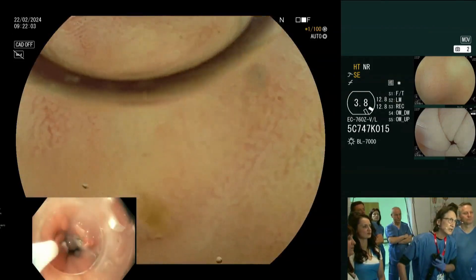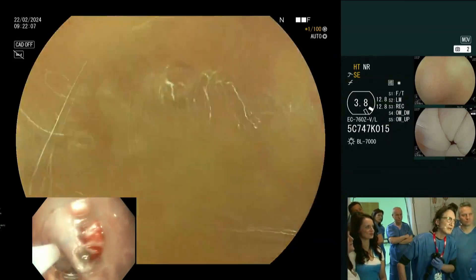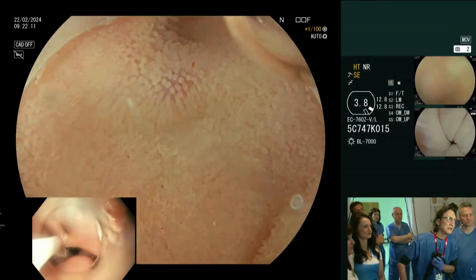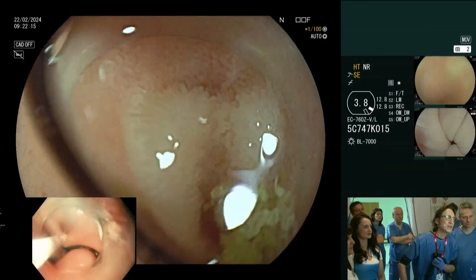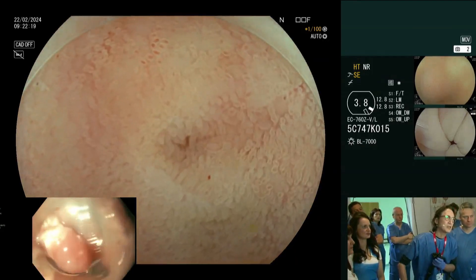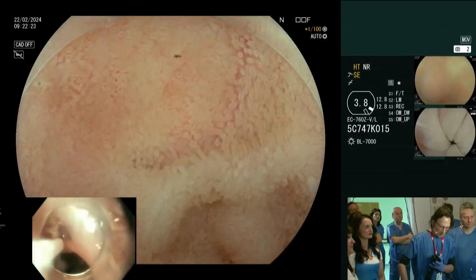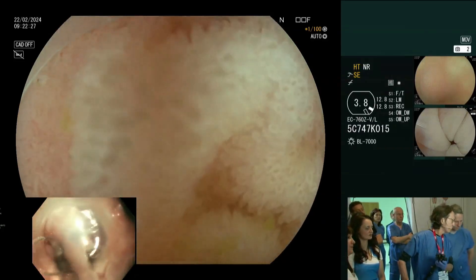Let's go on another level of near focus here. Look at these villi — you can understand why the surface area is increased by such magnitudes by these little villi. Look how beautiful they are. We can also use the equivalent of NBI — let's put that on for a moment. It's just another way of looking at it, and you can see the vascular pattern a little bit better like this.